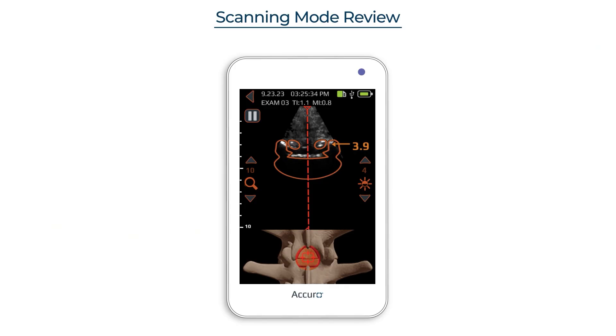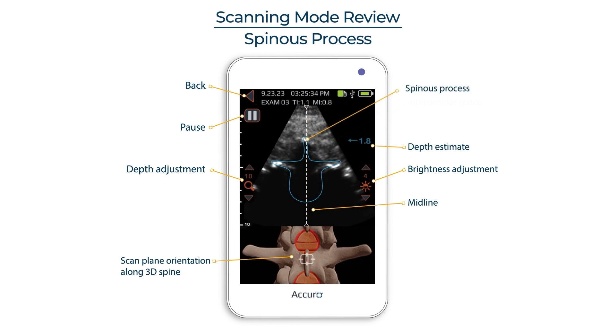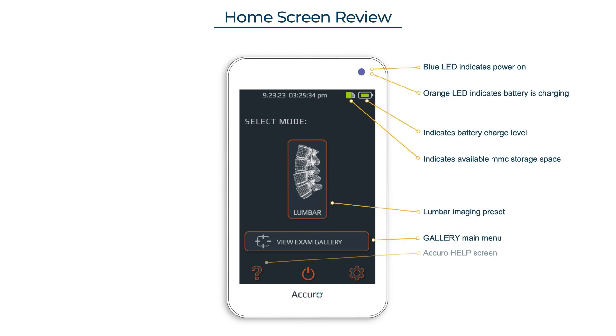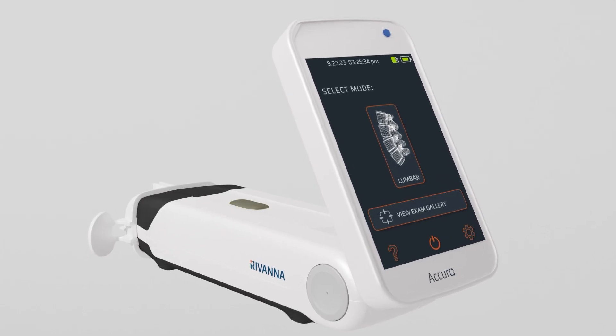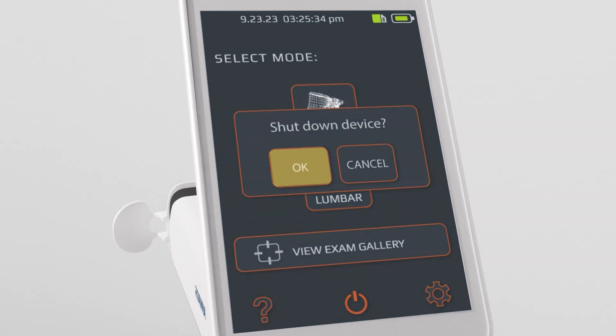Use your preferred method to identify the midpoint. Save battery by shutting down Acuro when not in use, or choose sleep mode by pressing the gray button while on the home screen.